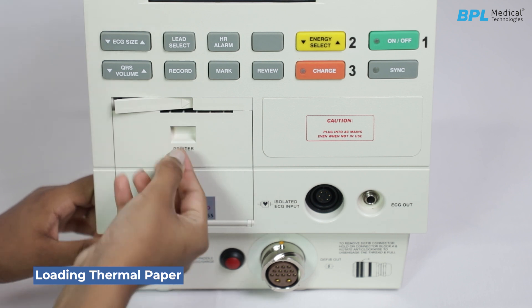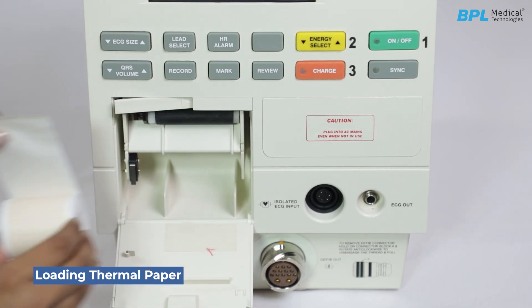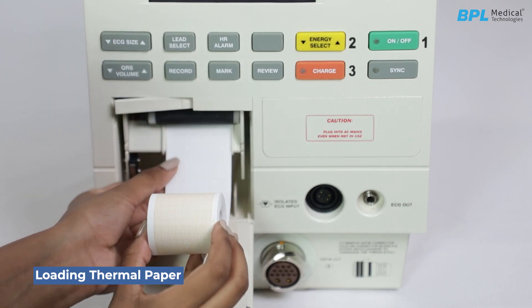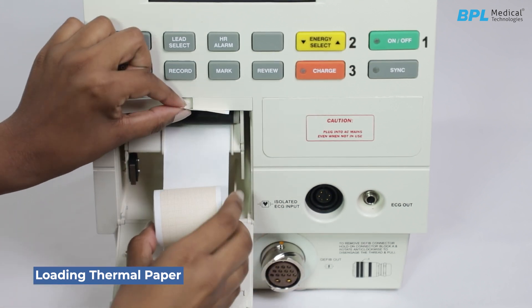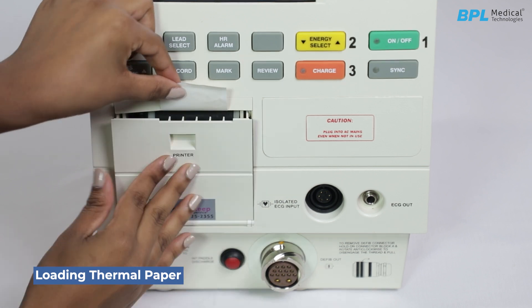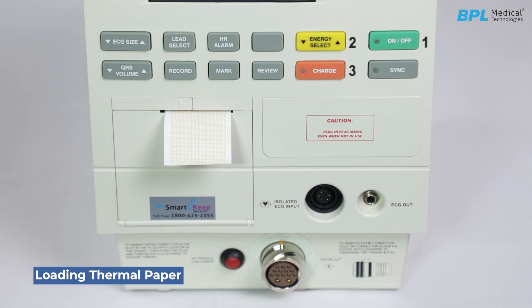Loading thermal paper. Push the lever fully by pressing on the mark to open the door. Insert the paper below the roller with the grid facing down. Make sure the paper extends about 25 mm above the roller. Align the paper within the provided guides. Push the lever back at the left end to prepare for operation, then close the printer door securely.